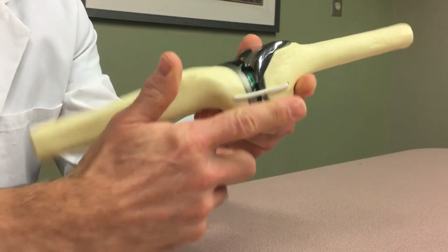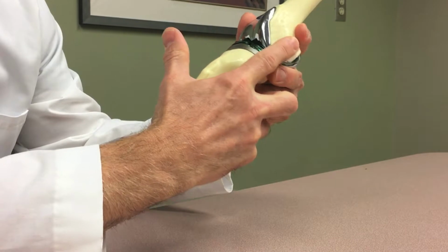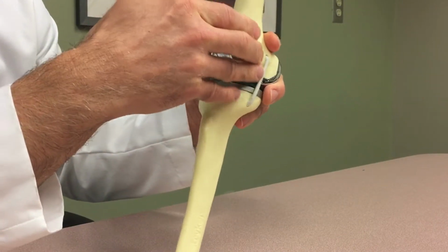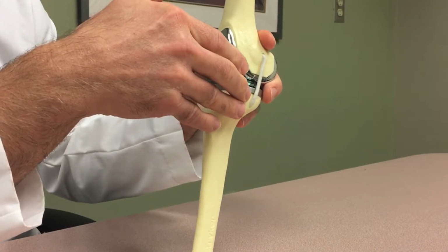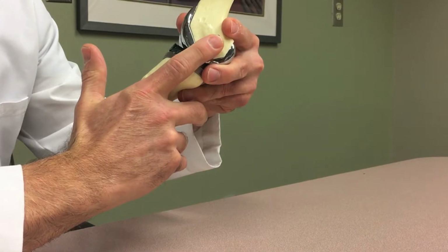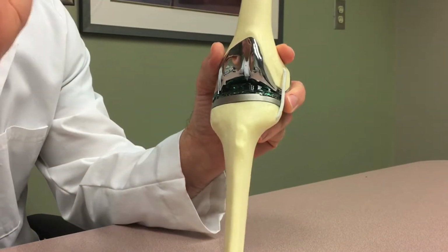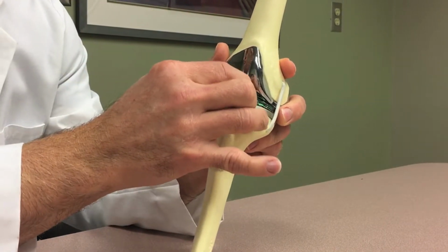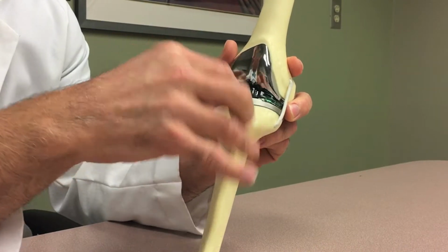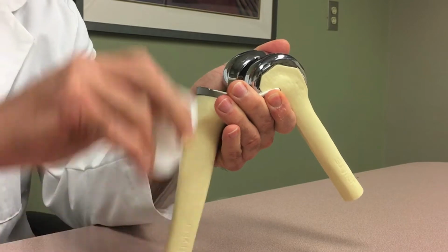Now, the ligament is a very broad ligament on the inside, about as wide as my finger, and it starts at the bump on the femur here and goes all the way down to the shin bone here. So if we're tight with that ligament, we can release it little by little from the bone, and that relaxes the ligament, allows it to slide up, and we can do it increment by increment until we have the same pressure on the inside as the outside, and that leads to a very balanced knee.